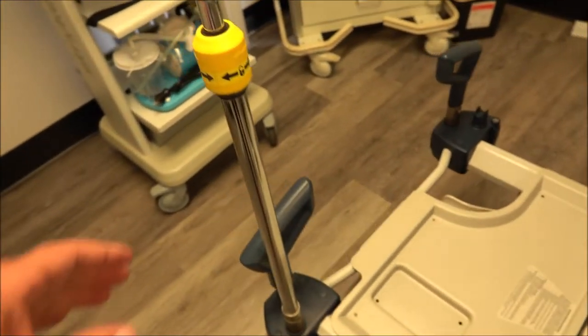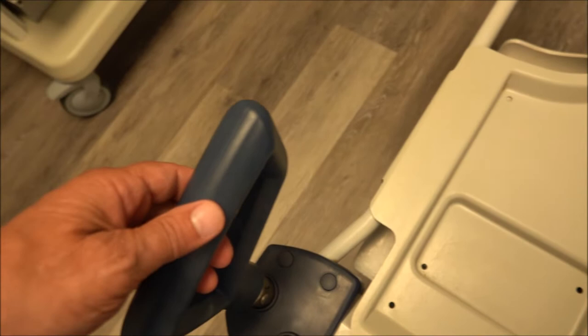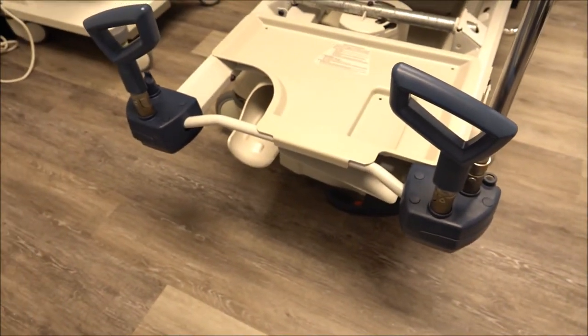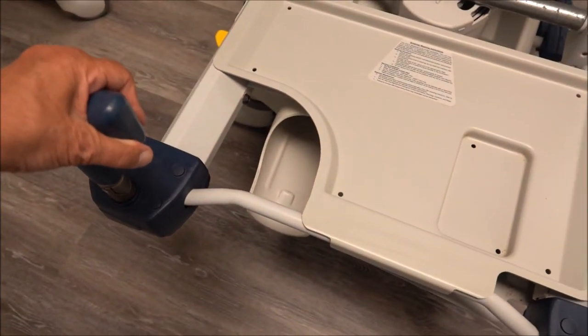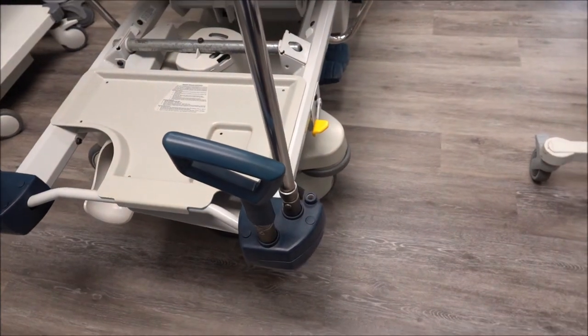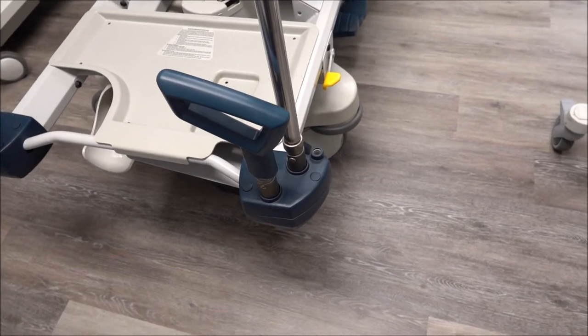It usually comes standard with an IV pole. The handles here are drop-down — they lift up and can be tucked right down, so if you don't want them in the way. These are really solid, thick handles, very durable. Some models from other brands can be a little more wobbly, but with these, they're very durable and very reliable.